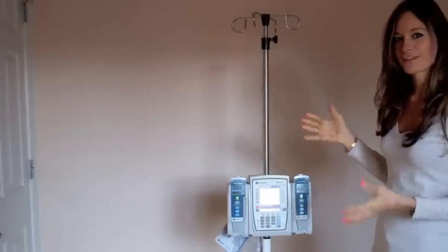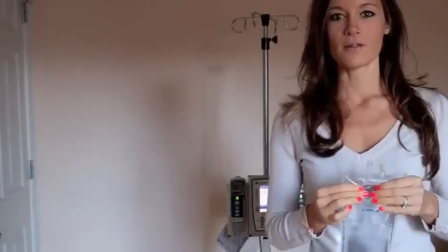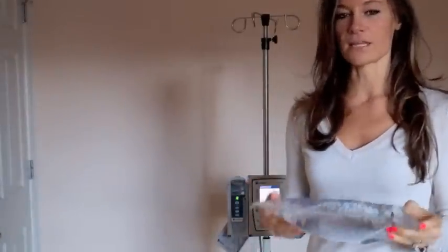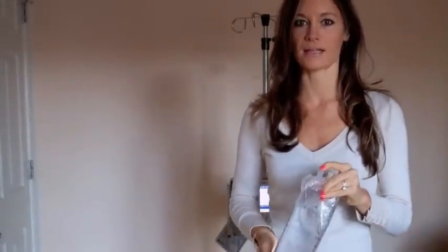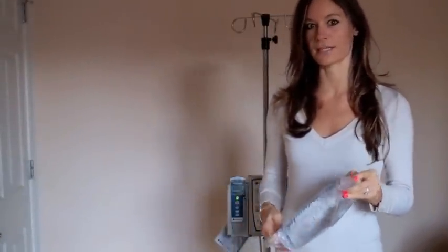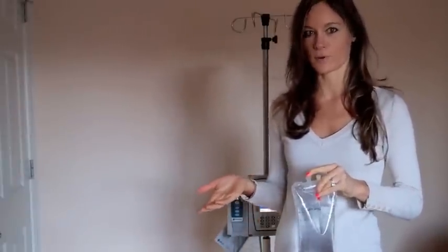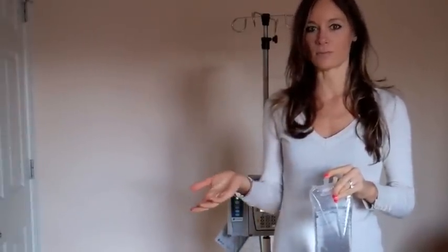Hi guys, welcome back to Empower In. It's Caroline Porter-Thomas and today we're going to learn a few things on the IV pump. The first thing we're going to do is figure out what's ordered. Let's say we have a basic infusion and what's ordered is normal saline. The doctor orders normal saline at 100 milliliters per hour for a patient that is admitted with dehydration.